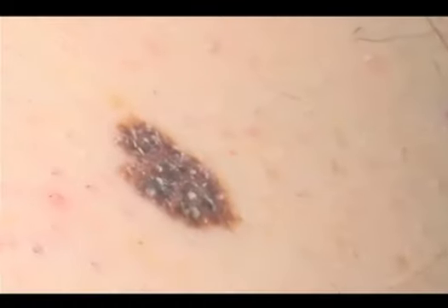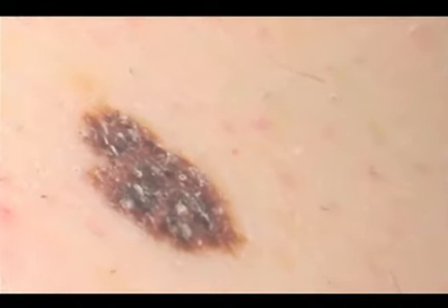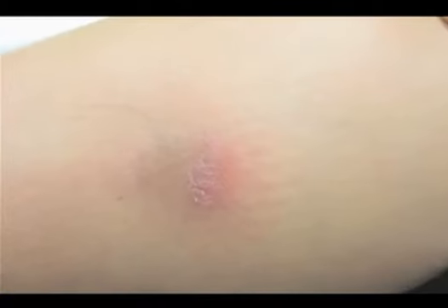Punch biopsies aid in the diagnosis of pigmented lesions and in the diagnosis of suspected skin cancers, generalized skin eruptions, blistering disease, and vasculitides. While paniculitides may be assessed with the punch biopsy technique, a wedge biopsy is preferred at some centers to ensure adequate sampling of the fat in such lesions.